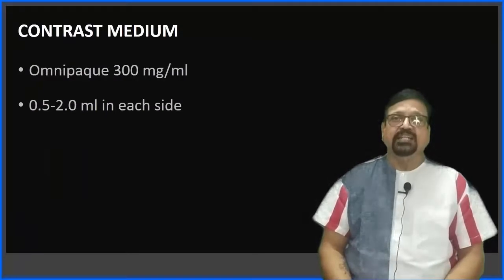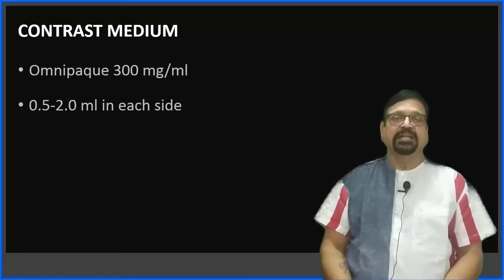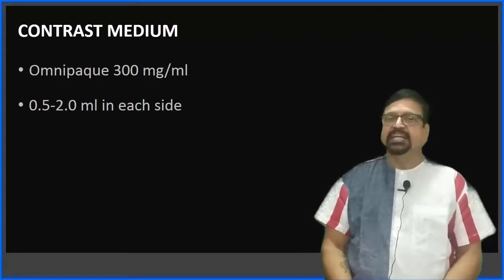Now what are the contrast media? That is the usual Omnipaque, which is 300 mg per ml, non-ionic, and it has extremely few side effects. It is very well tolerated. It doesn't cause conjunctival irritation or irritation after the procedure. So it's an excellent dye, which is hardly required in a quantity beyond 2 to 3 ml. It's extremely good. There are no side reactions and no local reactions, as we have found.